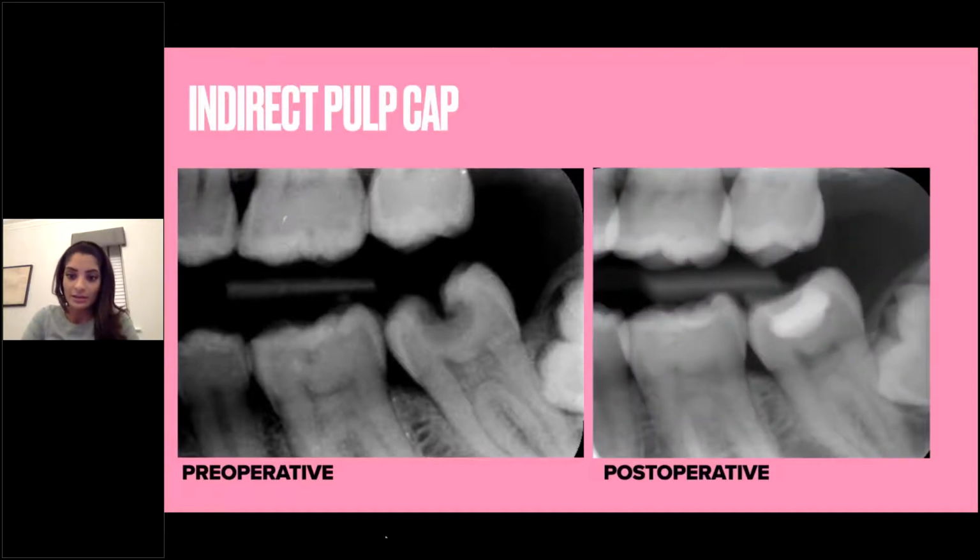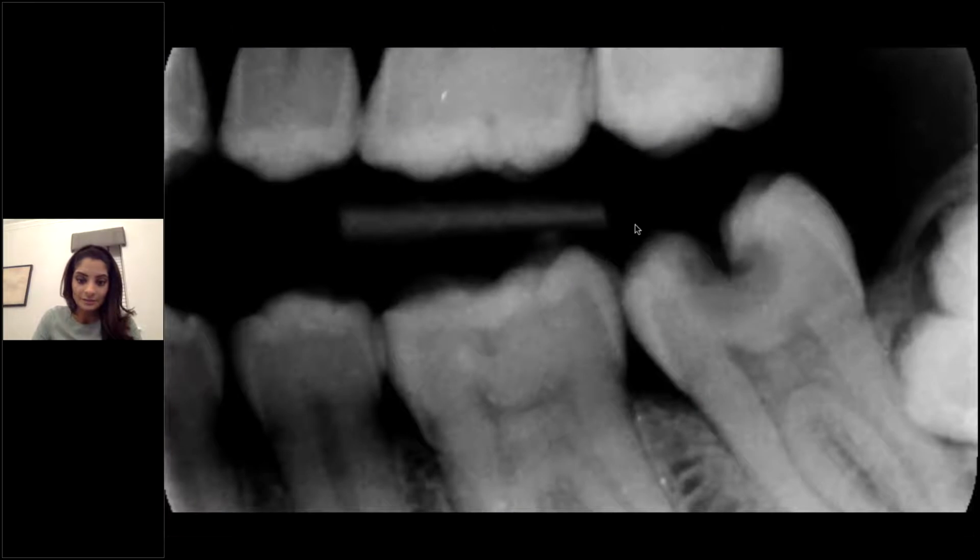This was the post-operative result. We can see here the bulk fill composite. There's a layer of normal composite on top of that, and you can't actually see the Biodentine pulp cap very well. That would be the one negative of Biodentine that I could think of, the fact that it isn't very radiopaque. It's got a radiopacity just over that of dentine, so sometimes you can't always see it very well on a radiograph. I've got a video of how I treated the case, so you can have a little look.